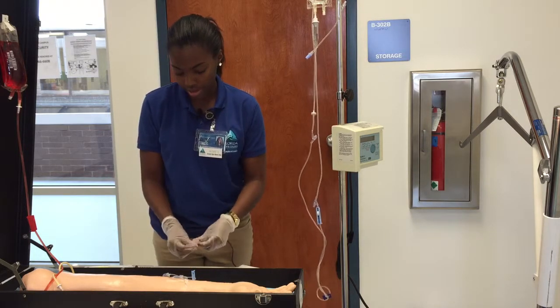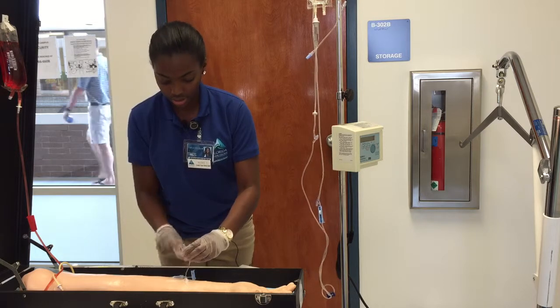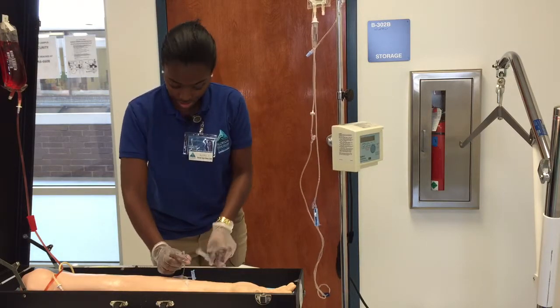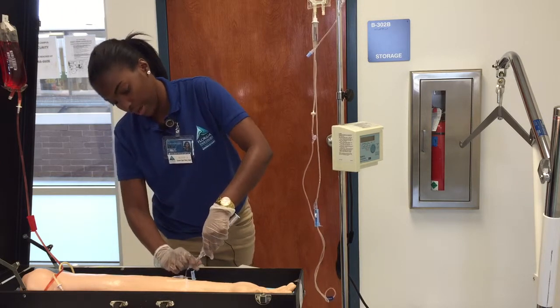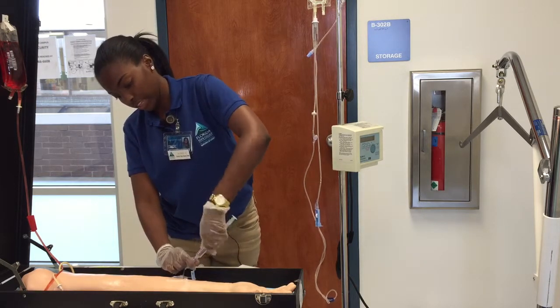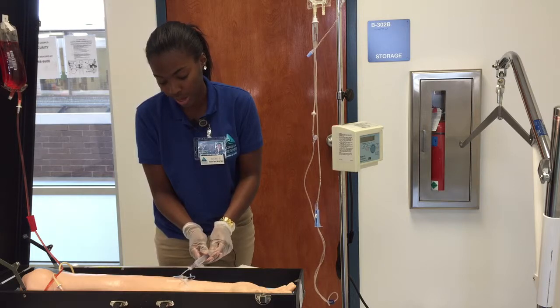And I would clean my area, clean the INT extension, like so. Okay, and then first I would do my ASASH procedure, so I would attach the syringe, it's 6 mLs already drawn up, and so I will insert 3 mLs of normal saline, and I'm going to make sure this is open first, and I'm going to aspirate, make sure I have correct placement still, so I have a blood return.